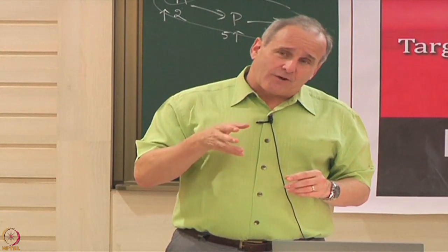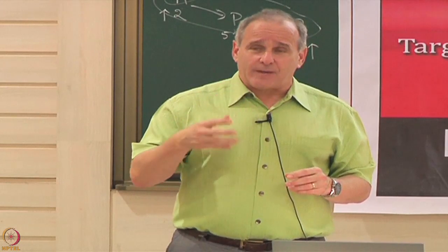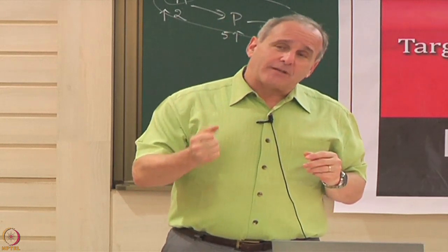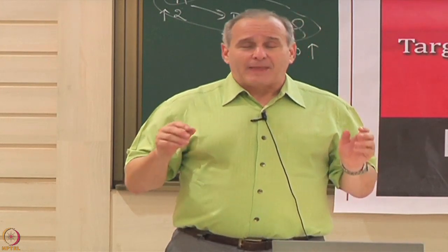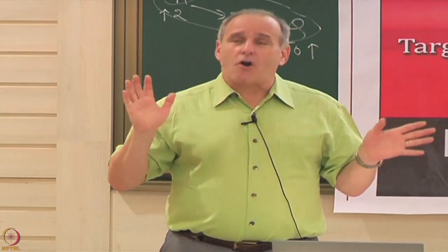The minute you activate the cross-linking agent, it's a free chemistry that starts to act on your sample. And if you let it go too long, everything gets over cross-linked and it's no longer functional. So the minute you add it to your print mix, the clock starts, and you have a certain amount of time to print it before everything gets ruined. Anything that doesn't get printed that day, whatever's left in your tube, it's gone forever.